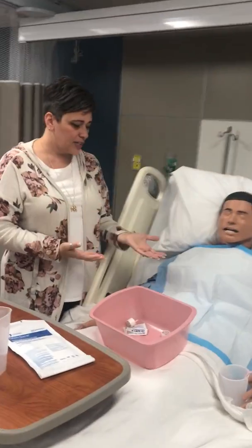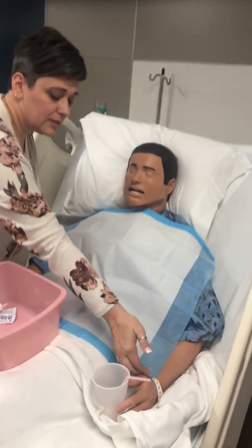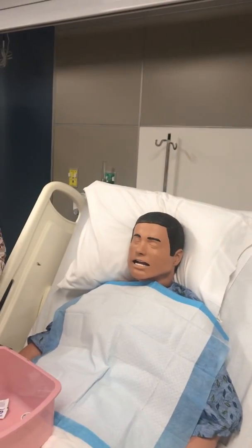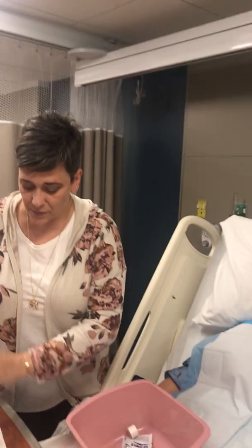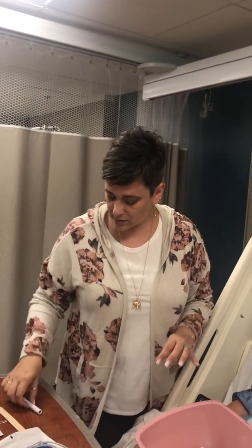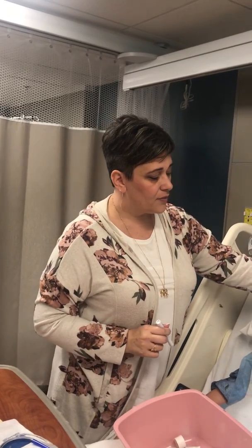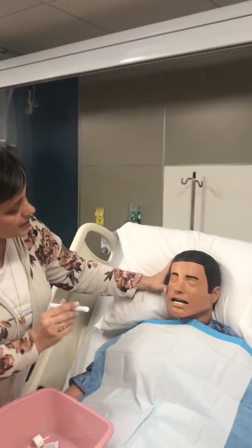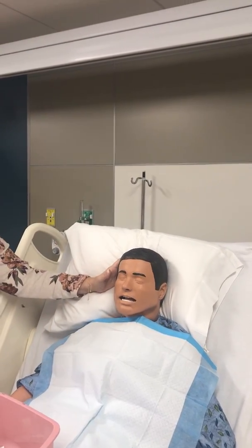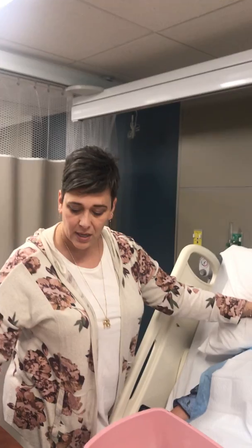I've already sanitized. I've already checked my ID and my patient by checking the name and date of birth to the MAR and to what they say. I've washed my hands. I'm going to ask them if they've had any facial fractures or facial surgeries, anything recently. She says no. I'm going to inspect and have them see which side is more patent. We're going to go on the more patent side, like we discussed.